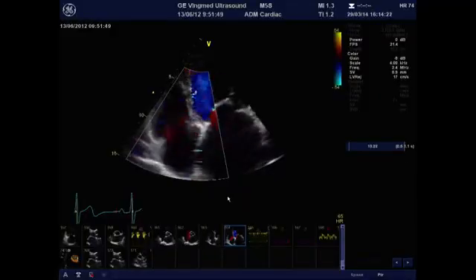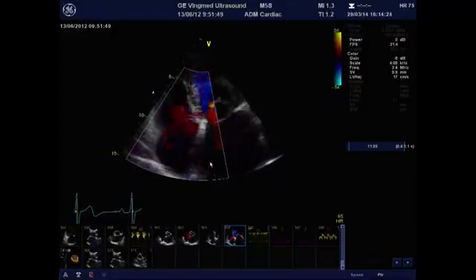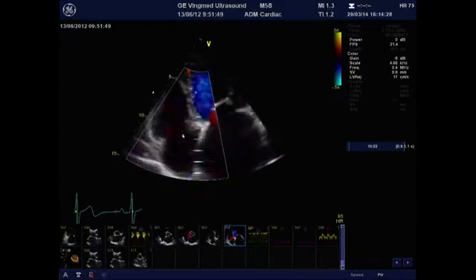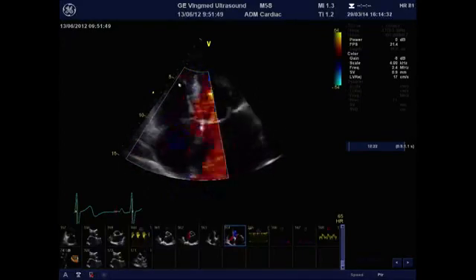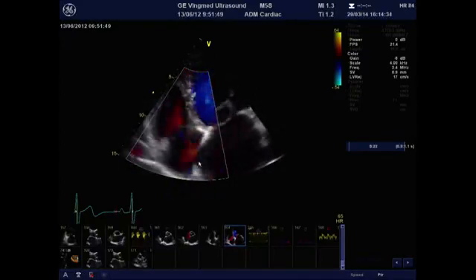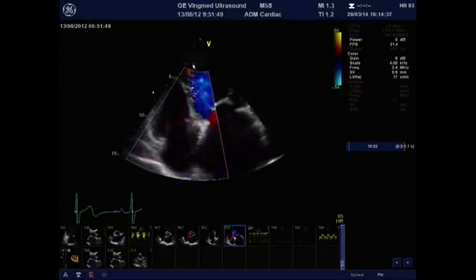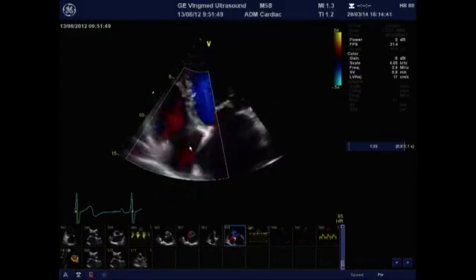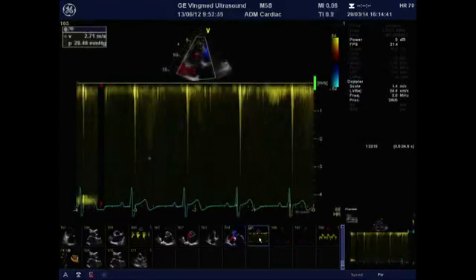So estimation of pulmonary artery pressure is also important in your patient with mitral stenosis, and you can do this using continuous Doppler by looking at the velocity of the tricuspid jet. I've put here the color Doppler on to detect the direction of the jet, and then the idea is to put the continuous Doppler well aligned with the tricuspid regurgitation jet to get the maximal systolic velocity across the tricuspid valve, and thus the maximal systolic pressure gradient, which is almost 30 millimeters of mercury.